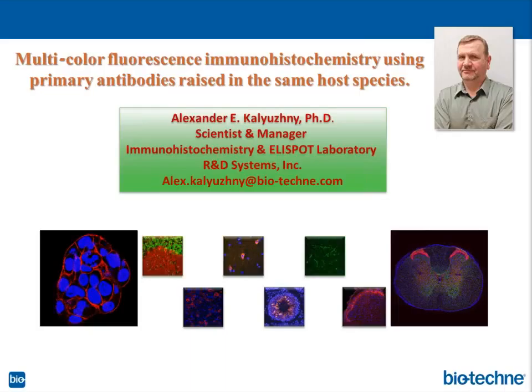Are there any drawbacks in mixing all hapten conjugated primary antibodies together for adding to tissue sections? We have not seen any obstacles or problems when we mix all these hapten conjugated primary antibodies. So I would say no. We don't see any problems doing this.